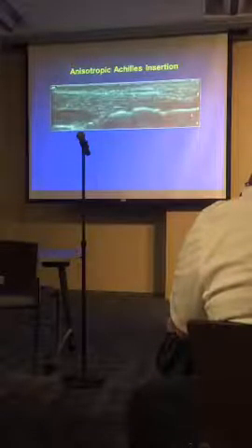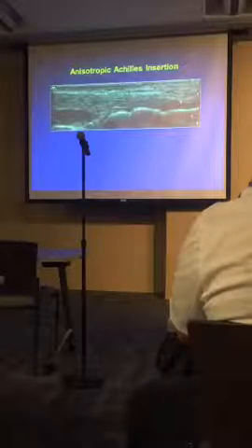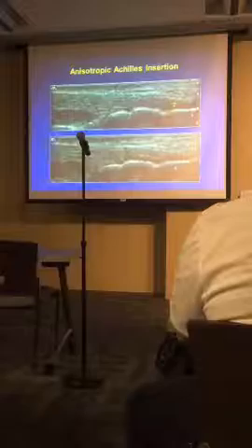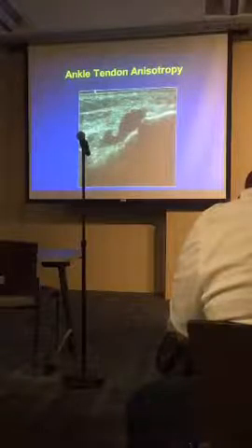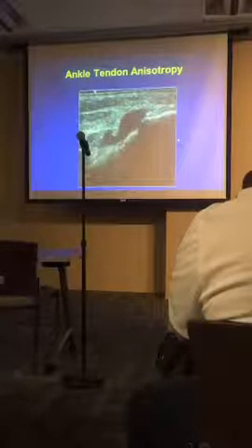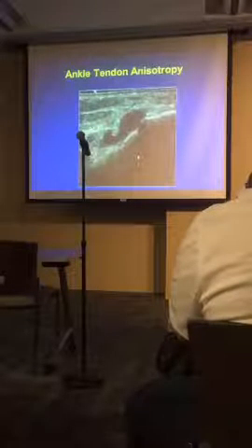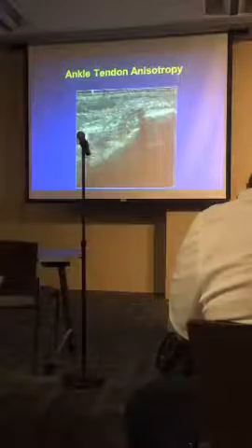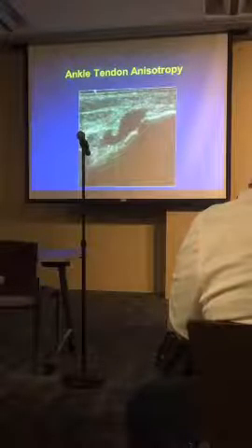For example, where the Achilles inserts onto the back of the calcaneus, the tendon curves down and an area may look dark. Rock the probe and you see a nice fibrillar pattern — no tendinosis or pathology there. Anisotropy also occurs in transverse views: a student might see hypoechoic areas at the medial ankle and think they're thrombosed veins, but rocking the probe reveals the brush pattern typical of tendons — the posterior tibial and flexor digitorum longus tendons were simply anisotropic.